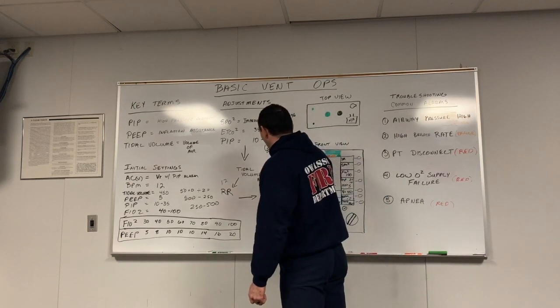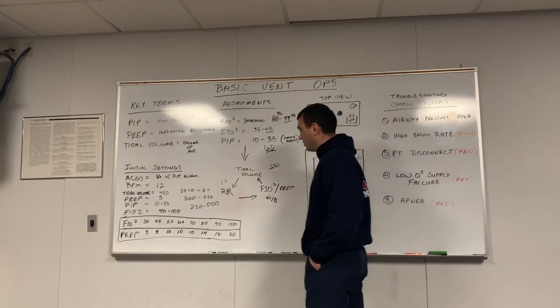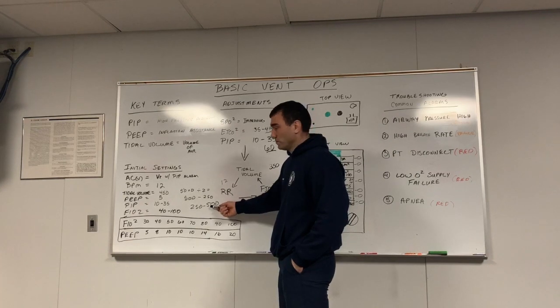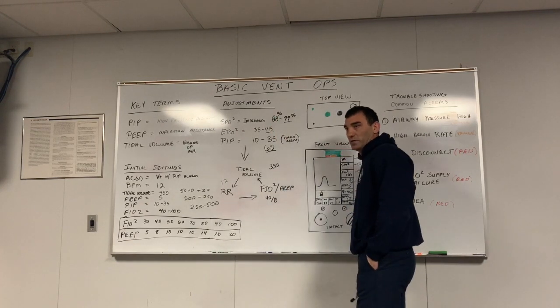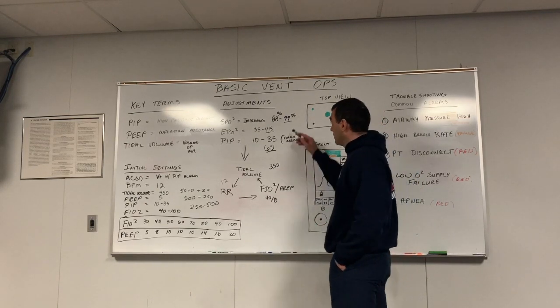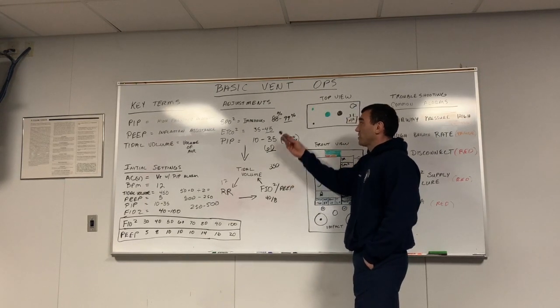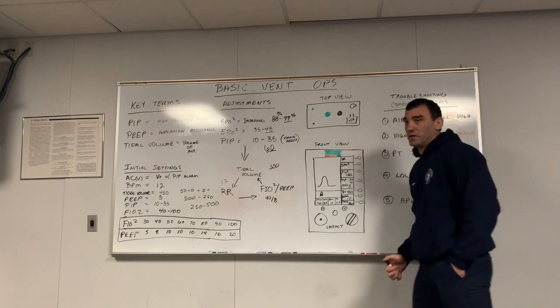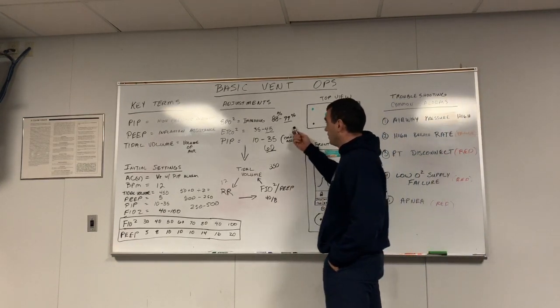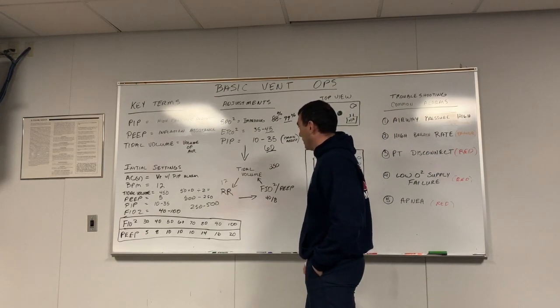Let's say we adjust it to 350. I realize, hey, this is not good. So I quickly do the chart in my head and I go, wow, I was on the extreme high side of my tidal volume. Let's take it down to 350 and put it close to the middle. So I do that, okay? We have to assume now that the tidal volume is lower, that this 99 is not gonna stay the same. So I'm gonna make that adjustment and then I'm gonna go back to my SpO2 and I'm gonna watch and see what happens. And now I'm just reassessing my patient. I made a change in treatment, so I reassess. Did the SpO2 drop? If it does not, we're okay. I go back to PIP and I see it drop.